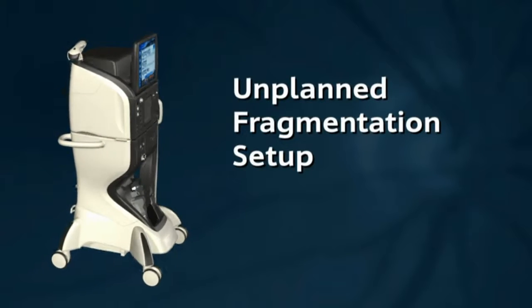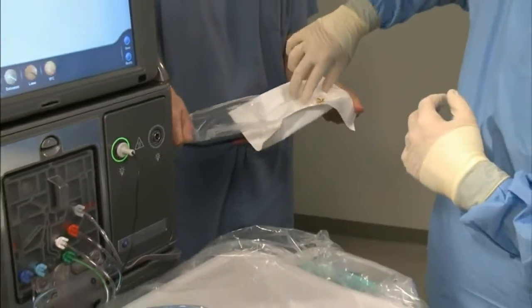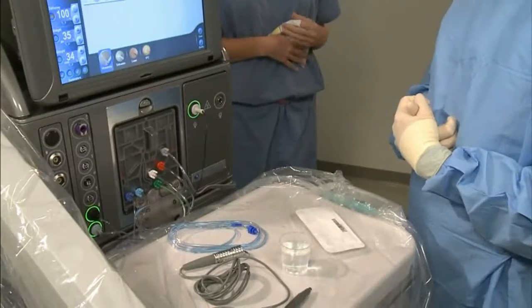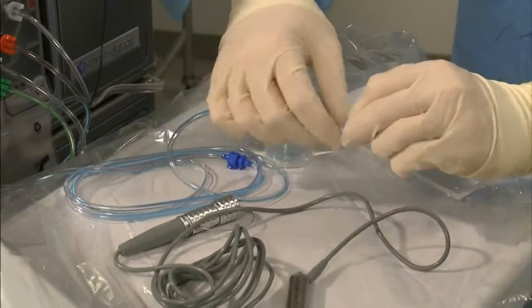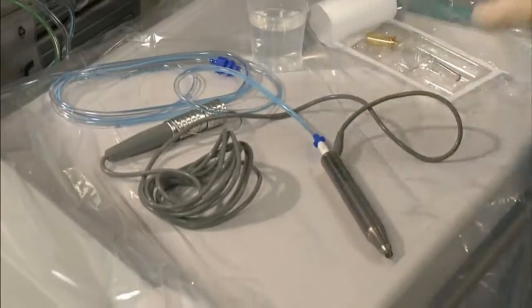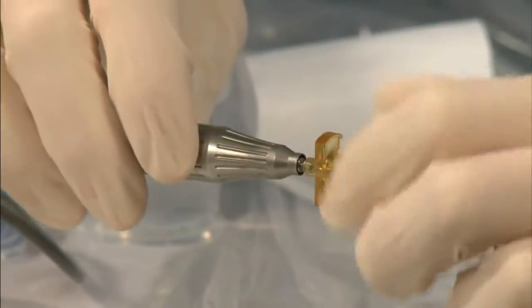This takes place during the vitrectomy procedure. After scanning, peel apart the fragmentation accessory pack and aseptically transfer the components to the sterile field. Connect the female-to-female connector to the light blue extrusion line. Connect the other end of the female-to-female connector to the fragmentation handpiece. Attach the fragmentation tip to the handpiece.